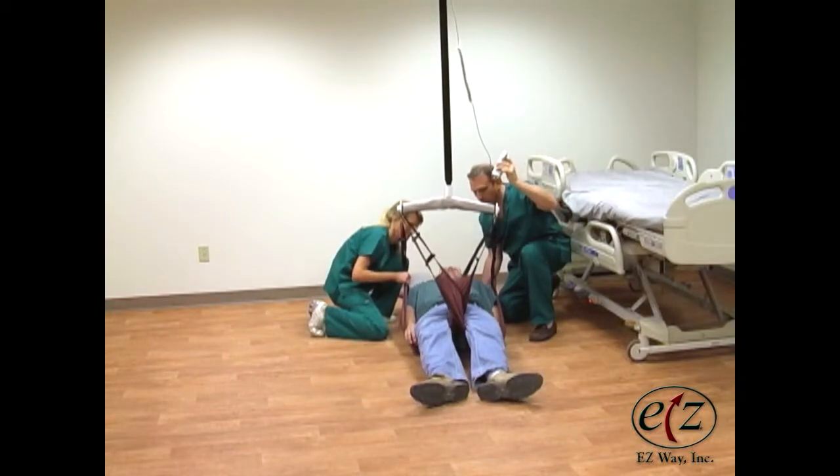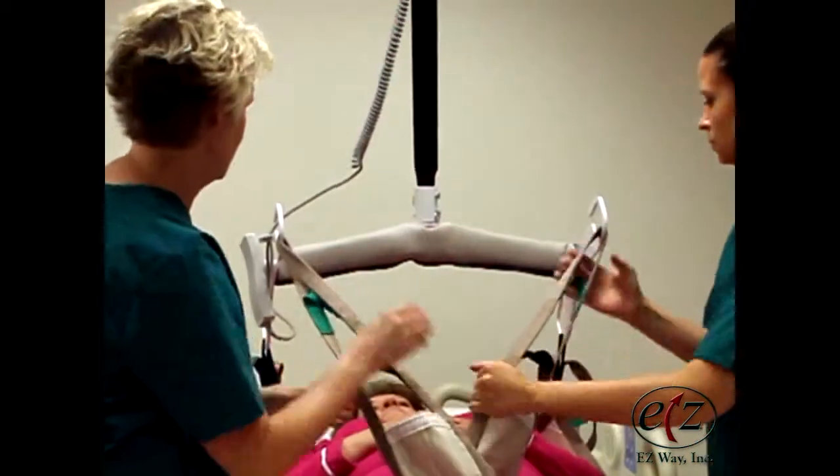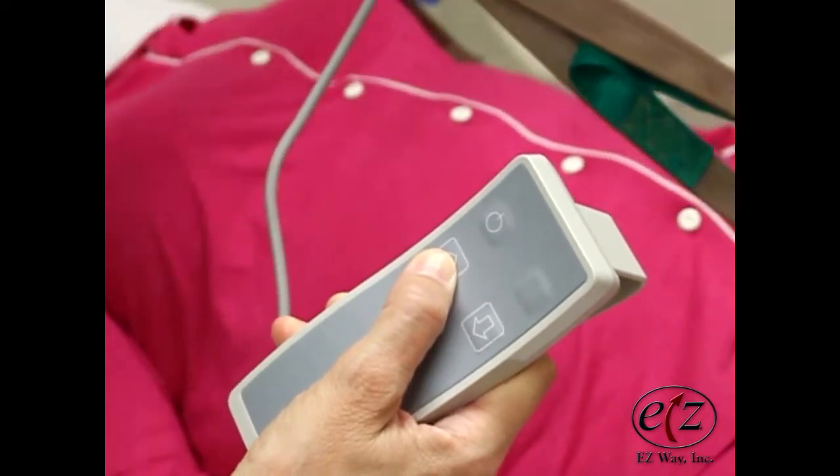Unless using a sling with head support, make sure to support the patient's head when lifting. Make sure all sling loops are securely hooked to the hanger bar. Push the up button on the hand control to raise the hanger bar.